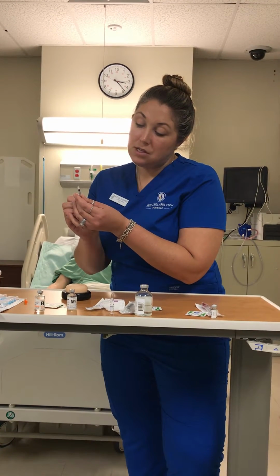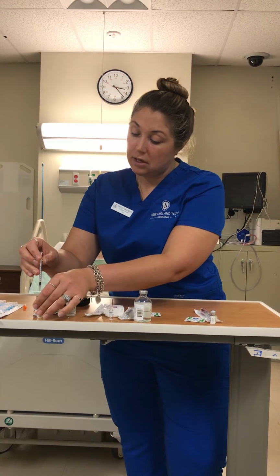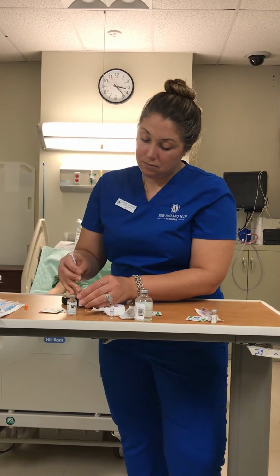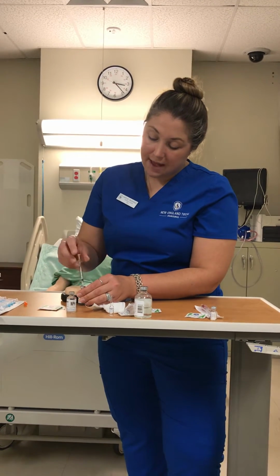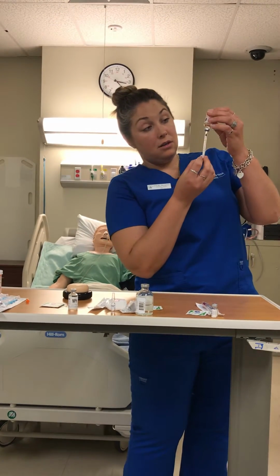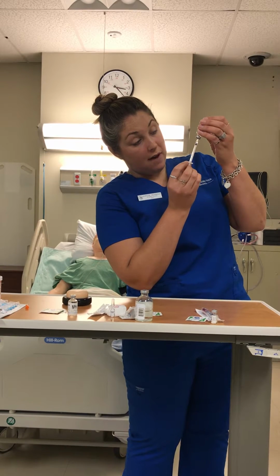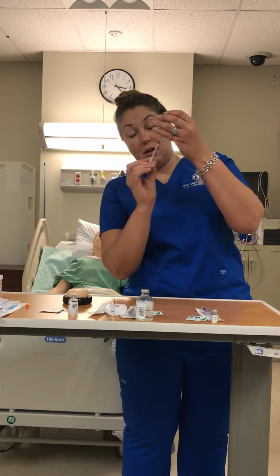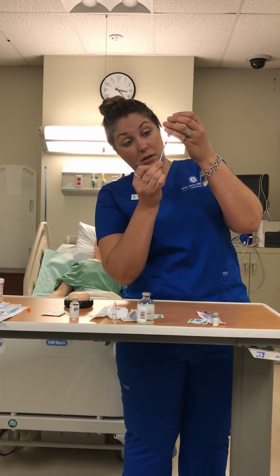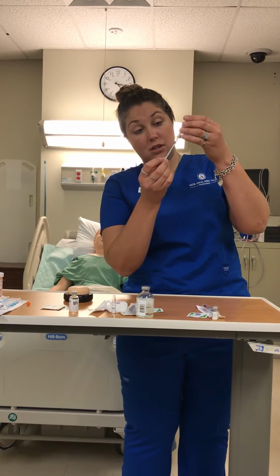pull back to the 5 unit, and stick it into the fast-acting, and then you're going to immediately turn it over and pull up 5 units, making sure that there's no air bubbles. If there are air bubbles, you can push the plunger back in, but not with the second one because you already have medication in this one.